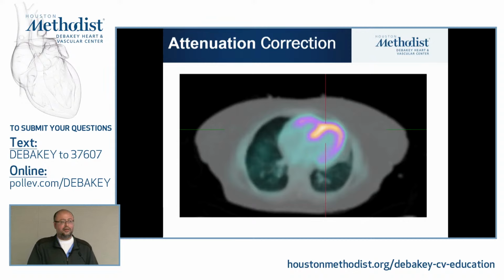When you do attenuation correction, whether on SPECT or on PET, you could potentially fix artifacts, but you could also introduce artifacts. All of you know, when you read with us, you could get some artifacts when you do this. The most common artifact is misregistration artifact. What does it mean? Because the CT is acquired separately and the PET is acquired separately, you have to fuse the images.